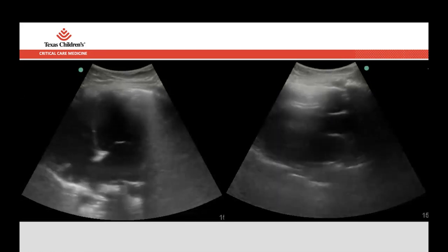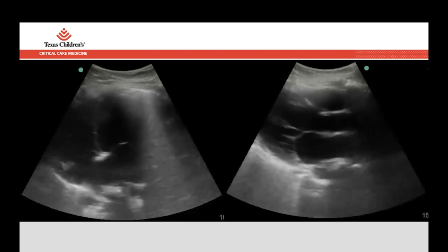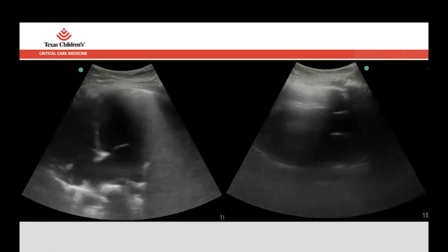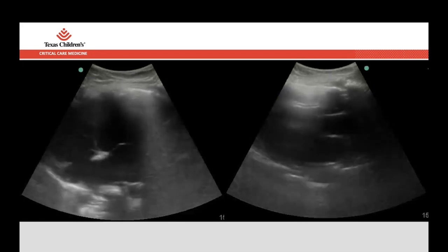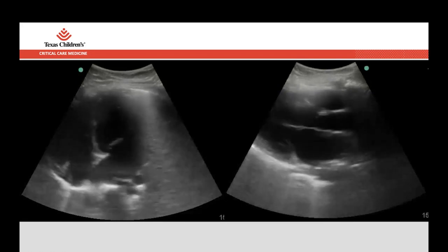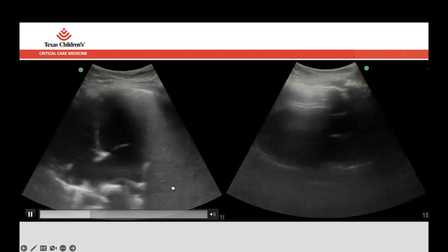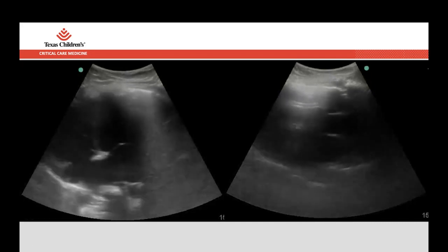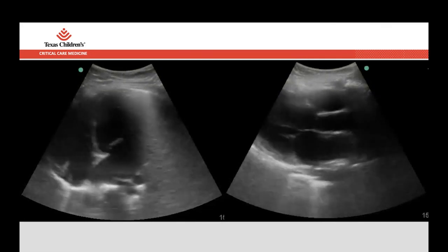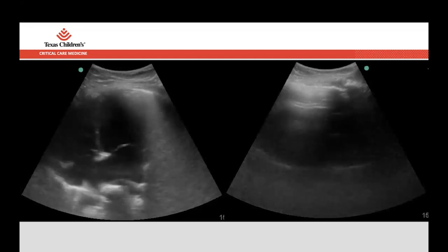But even a dead heart will move if it's tethered to something else that is moving. And then sometimes we foreshorten, we miss the structure. So looking at the total picture for other clues helps you validate that. But yeah, you're right. Most people, as soon as we plop the probe down, say we have a functional problem here. And this was worse than a baseline echo.